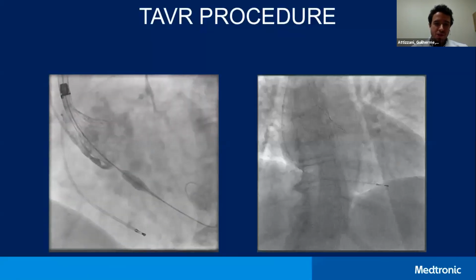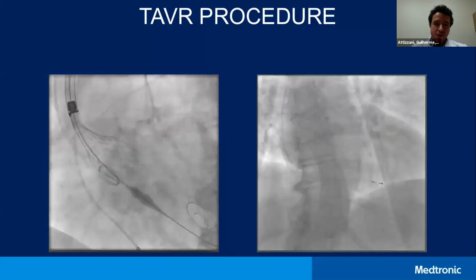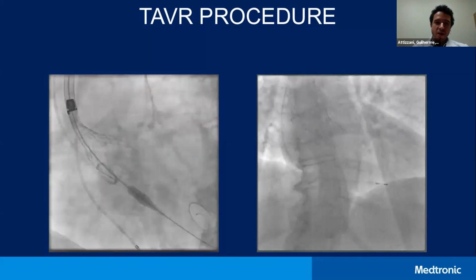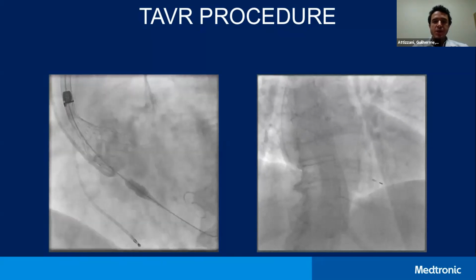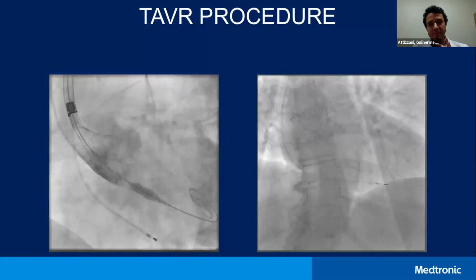And the procedure is just not the point of the discussion here, but I think the point of the discussion is when we have to select valves appropriately, even more so when we're dealing with low surgical risk patients, younger folks who are going to have a much more active lifestyle.